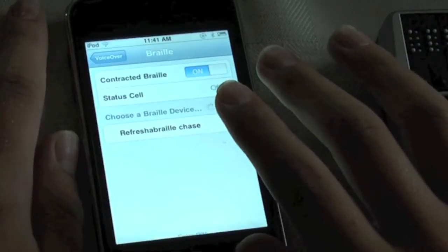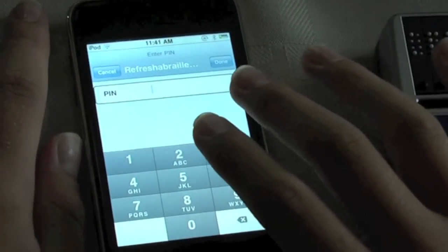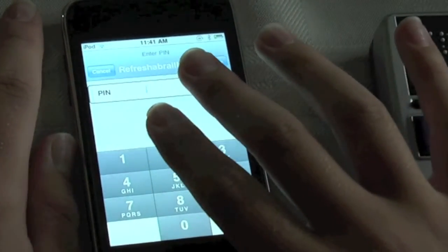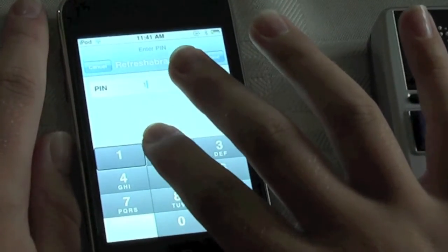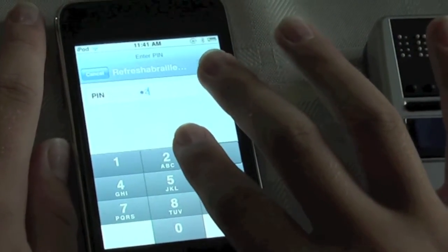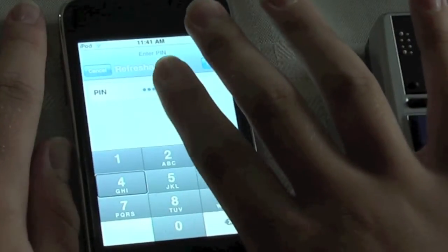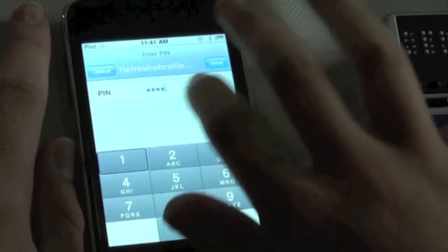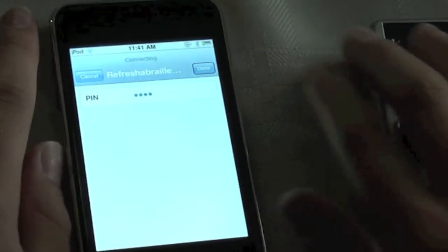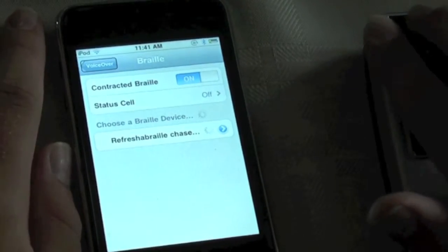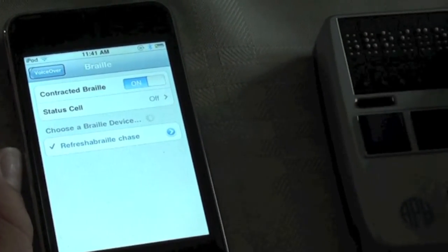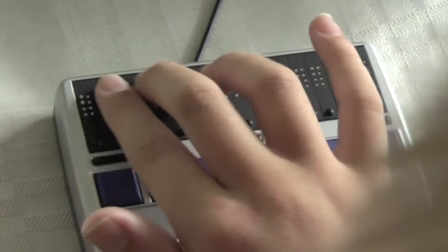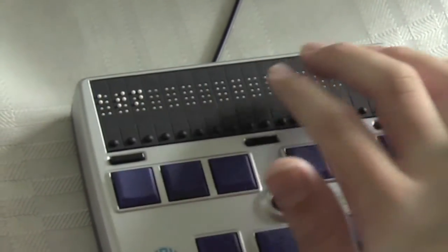The display is asking for a PIN code showing 1234. My display just went blank. And now we see VoiceOver back button on the Braille display.